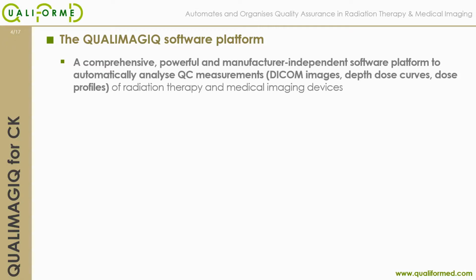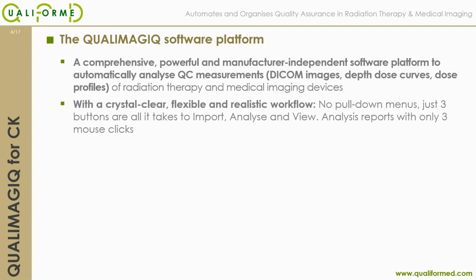Various QUALIMAGIQ modules are available to automate QA for all imaging modalities: CT scanners, MRIs, digital radiology, and nuclear medicine. In radiation therapy, the software can be used with conventional linacs as well as with tomotherapy and, of course, CYBERKNIFE devices.